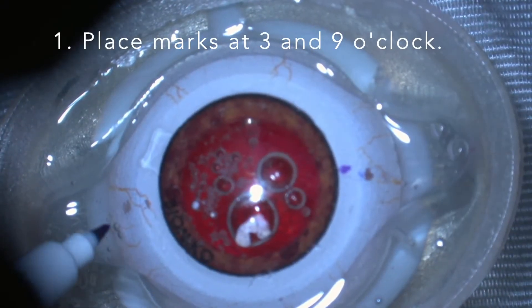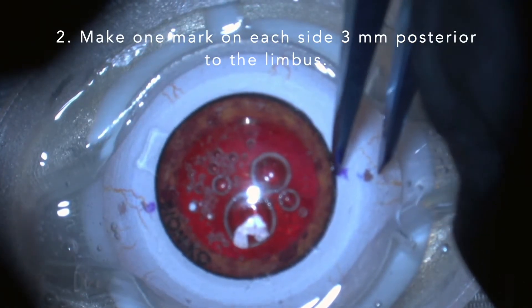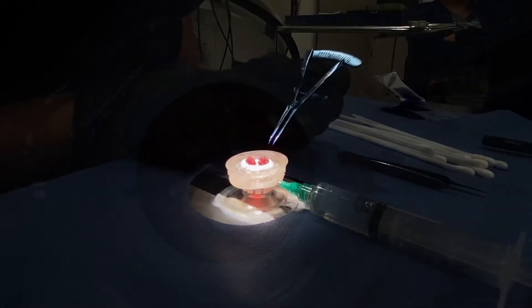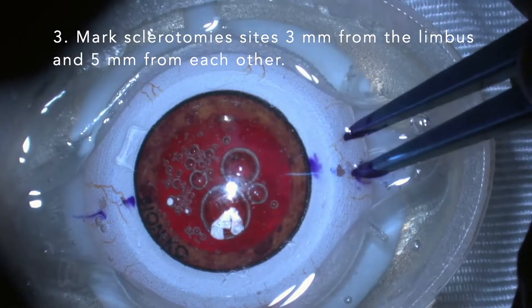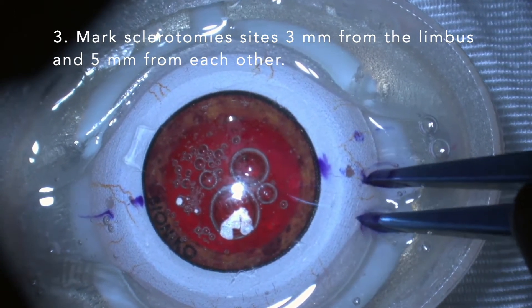First, we place marks at the horizontal axis. Then we place one mark on each side, 3 mm posterior to the limbus. Mark the sclerotomy sides, 3 mm posterior to the limbus and 5 mm from each other.